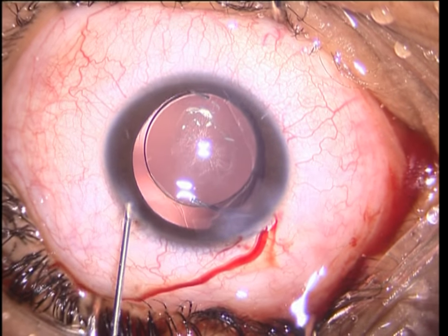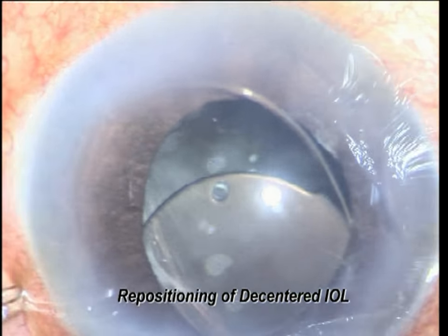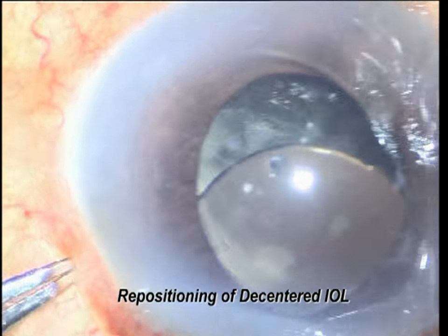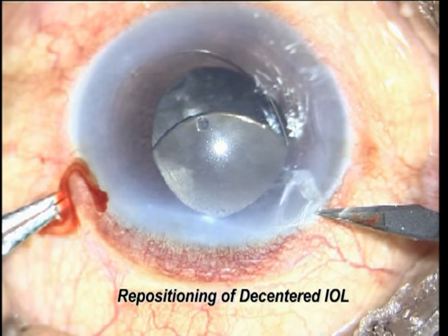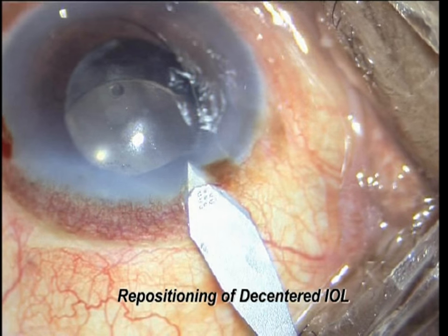To enter vitrectomy with triamcinolone if needed — triamcinolone will help to recognize the vitreous.